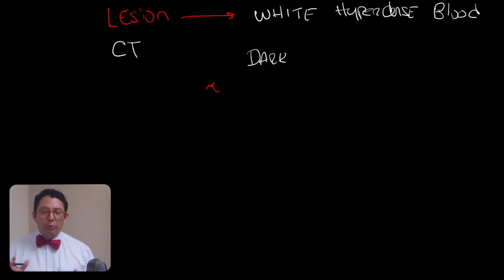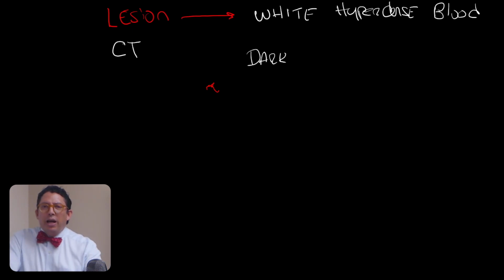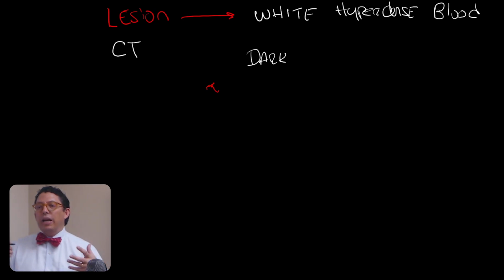There's an exception, and we have a very important trauma center in our hospital. And think about it. When can you have acute bleeds that are really not hyperdense? That's kind of the same as asking you, can you have acute bleeds in patients that have low iron in their blood? Yes, they can be anemic, but when do you think a trauma patient really gets here and you can have bleeds that are not that hyperdense?